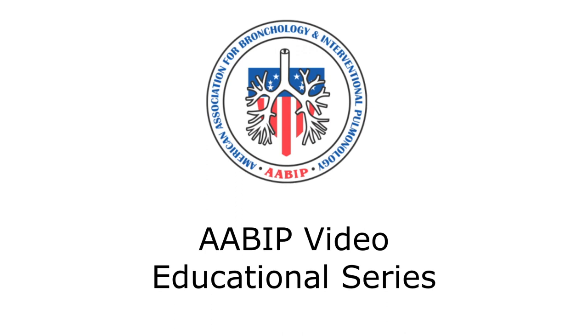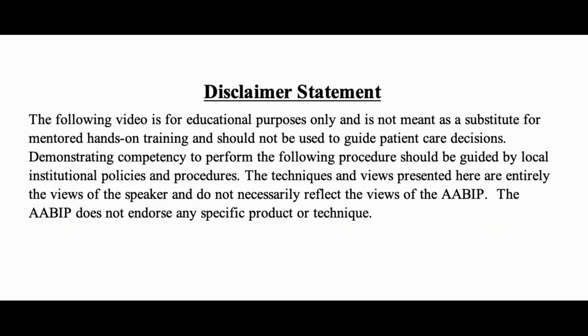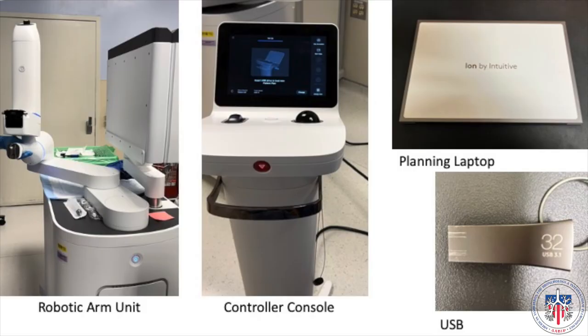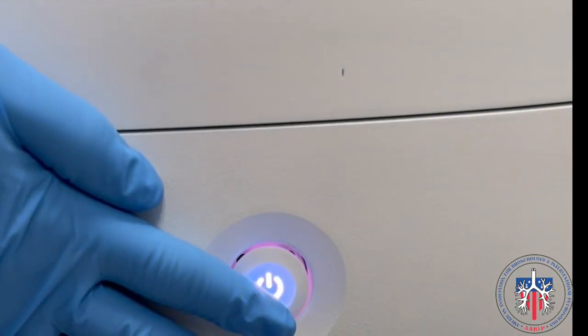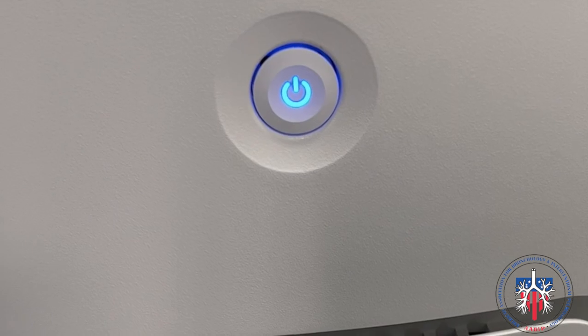This video will demonstrate robotic assisted bronchoscopy ion equipment and setup. The ion robotic system comprises of the robotic arm platform, controller unit, planning laptop, and an encrypted USB. The system is stored plugged into the outlet at all times. A steady blue light indicates system startup has been initiated.